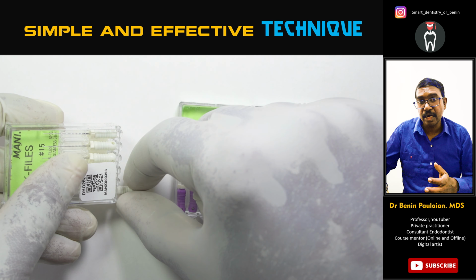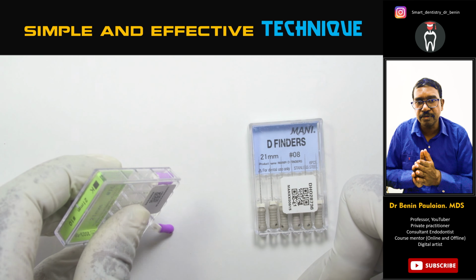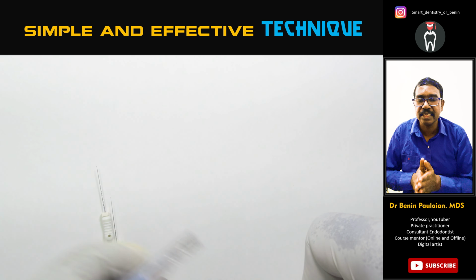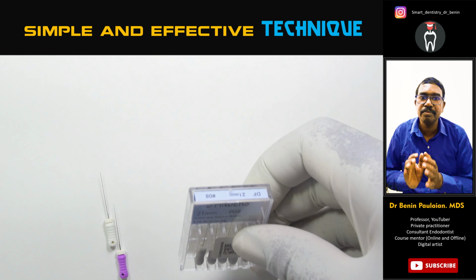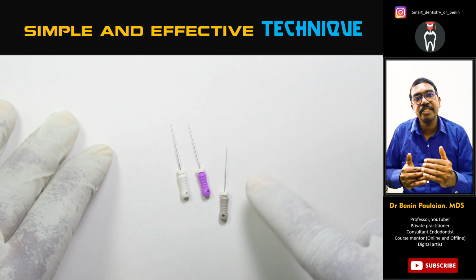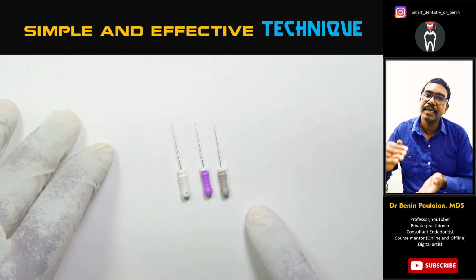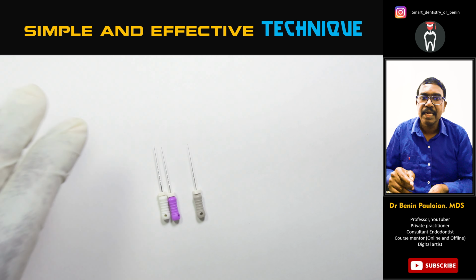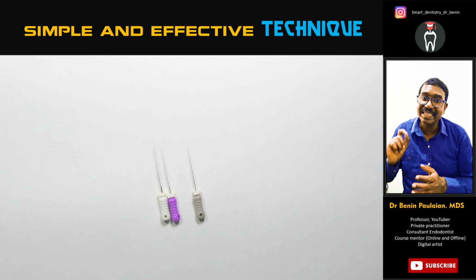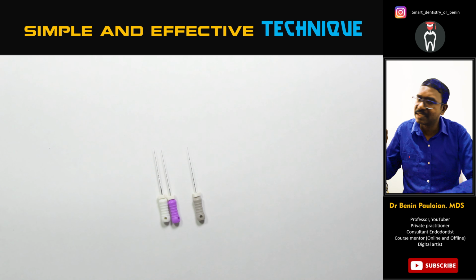So in order to enhance the rigidity of a smaller file, we have to always go for a file which is of shorter length. So for canal negotiation, we should always use a 21 millimeter file and not a 25 millimeter file. If the canals are more than 21 millimeters, now you negotiate the canals to 21 millimeter, then you can proceed with a 25 millimeter file. So this helps a lot in canal negotiations. So these are the 3 files.